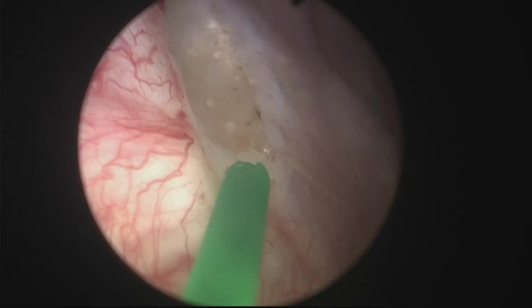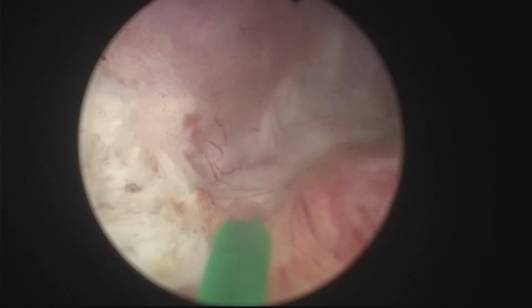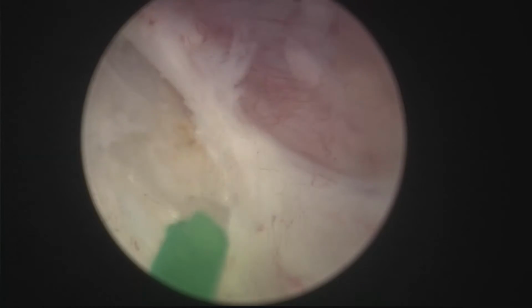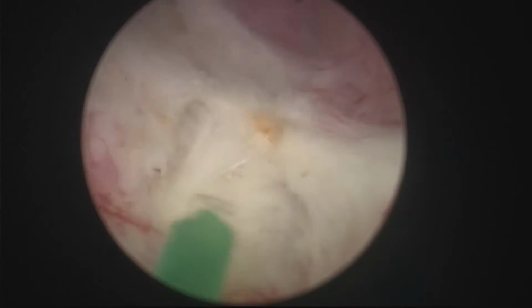Apparently there's a favorite side for surgeons, like, remember when we did TURP, you would feel more comfortable resecting on one side than the other side. So maybe the job was better on one side than the other side. So here you can see the marking of the white line.